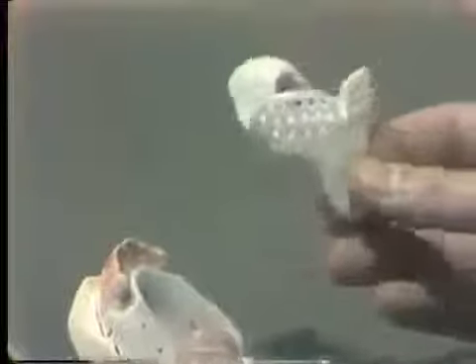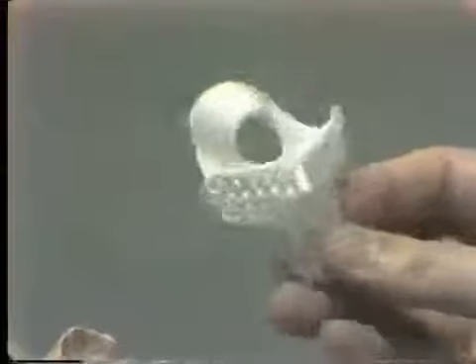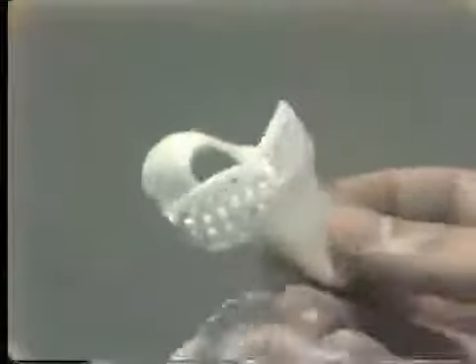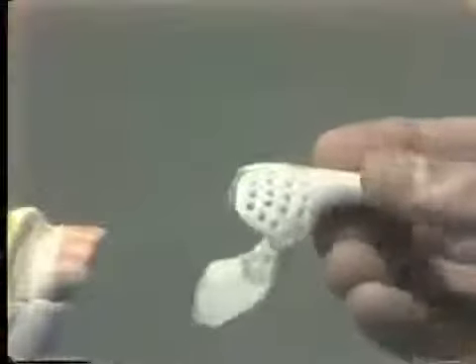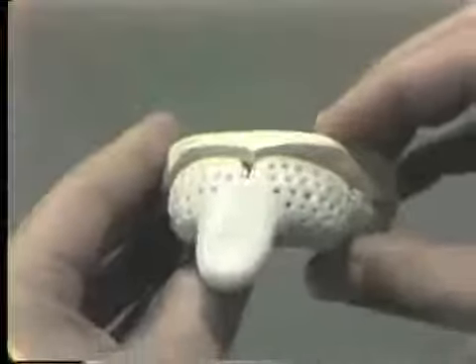The alginate, which we use for the second half of this final impression, is then mixed and placed in our custom anterior segment here, making sure that the alginate oozes through these holes so that it locks firmly to the tray, and then this second tray is inserted in the mouth right over the first tray.